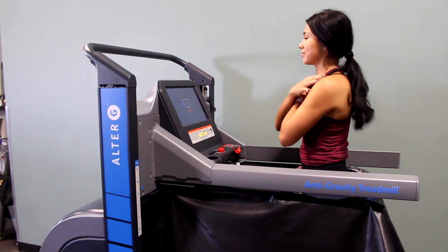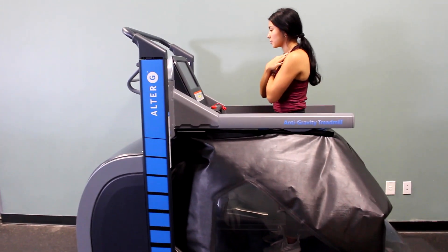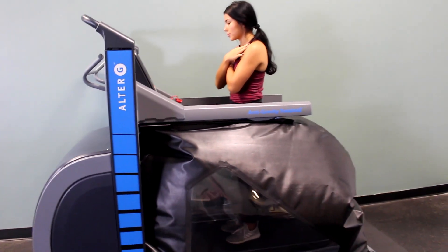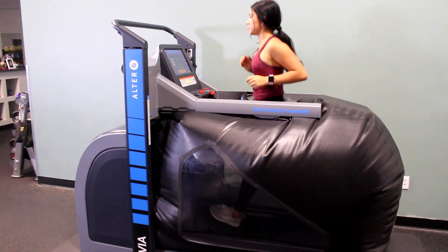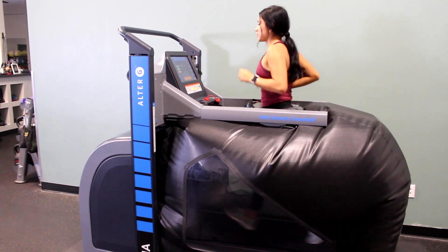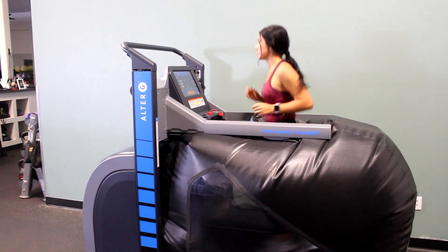When you step into the Alter-G treadmill, you will adjust the settings to remove some of your body weight. You can take the resistance all the way down to 20% of your body weight. The unique fall-safe environment coupled with the positive air pressure chamber makes the Alter-G a great option for post-operative patients, elderly patients, and patients with extreme injuries.